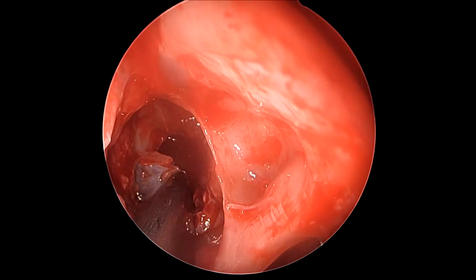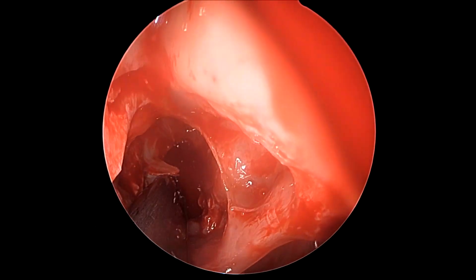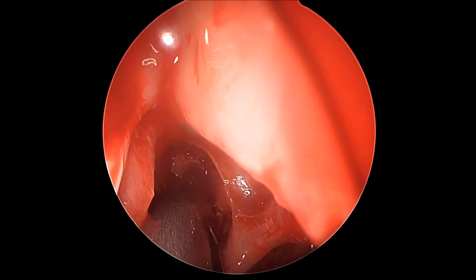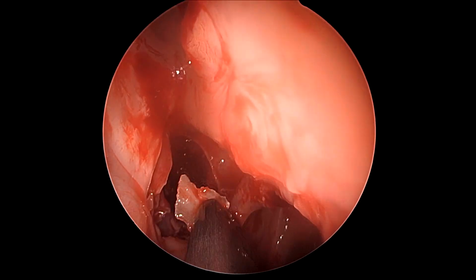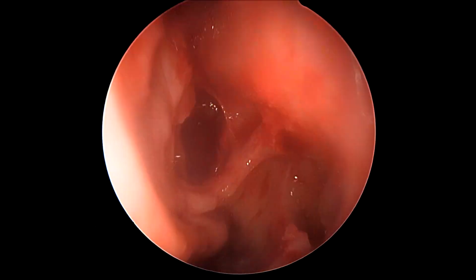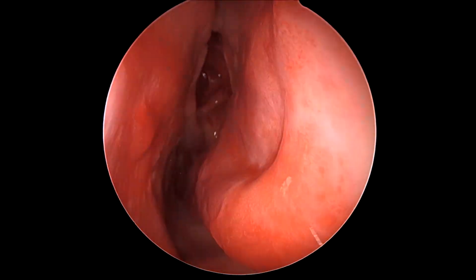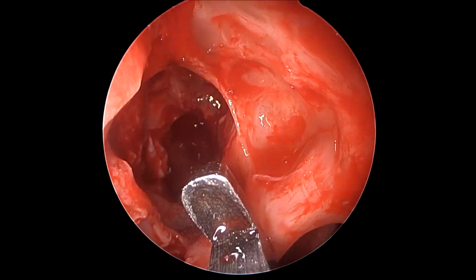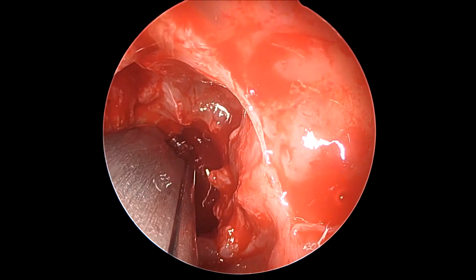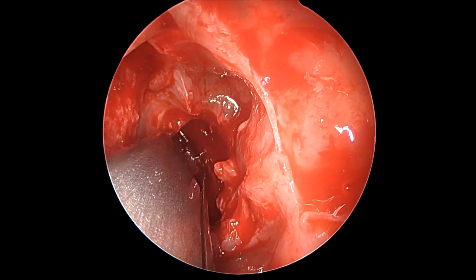So here we still clear some more bone to create a wide straight corridor for irrigation, so that the irrigation fluid reaches the sphenoid sinus very easily and appropriately. And that would also help us see our superior limit, the superior limit of the sphenoid, and we could then move forwards and anteriorly towards the posterior ethmoids.